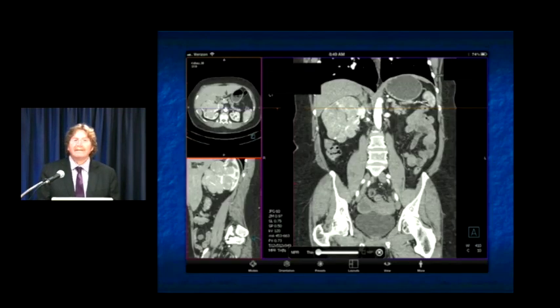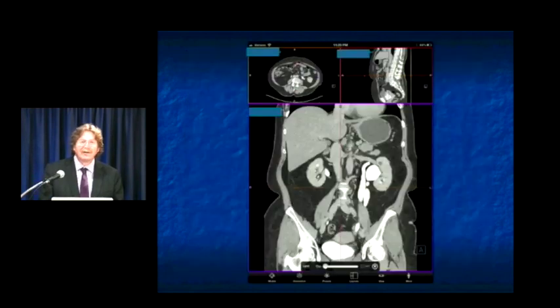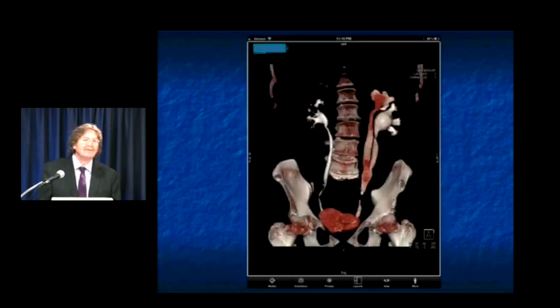And the quality, the iPad, Apple does a good job. Steve left behind some really talented people. I mean, look at the quality. You can do multiplanar. You can look at things with any perspective. You can do 3D. You do interactive rendering, and it's only going to get better.